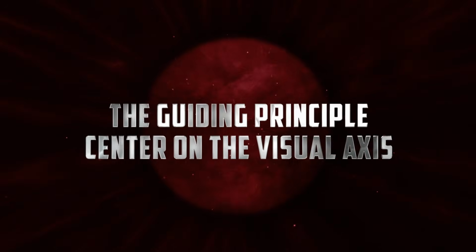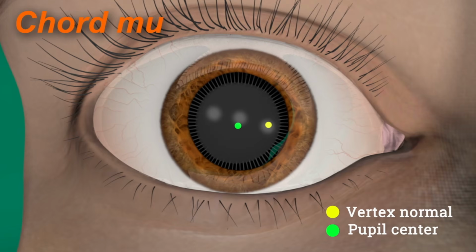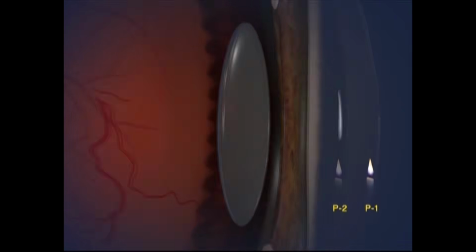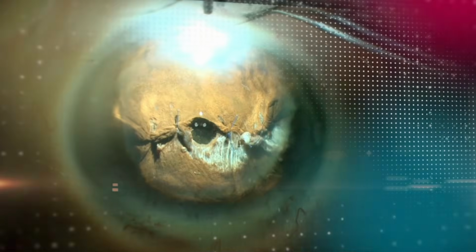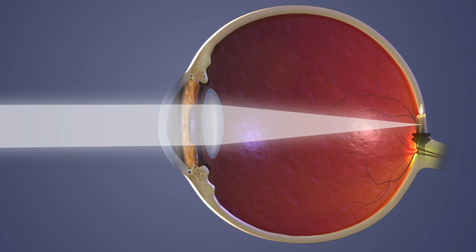The guiding principle: center on the visual axis. The first principle of pupil restoration is centration, not on the anatomic defect but on the visual axis. The first Purkinje image provides a reliable intraoperative landmark. Every reconstruction must align with this axis because vision is determined not by where the iris appears center but by where the light enters the eye.